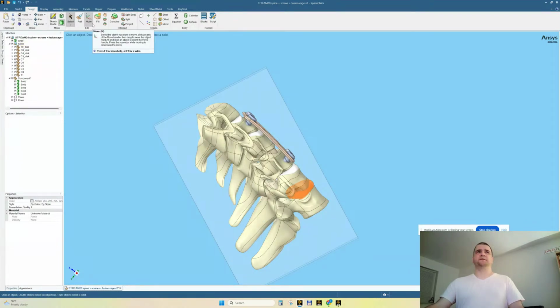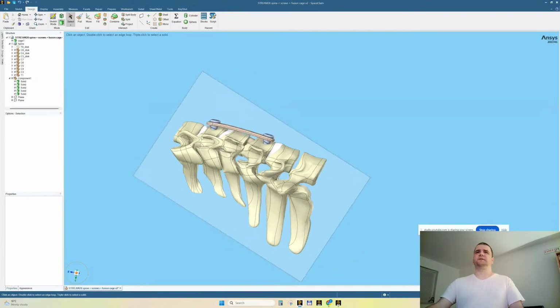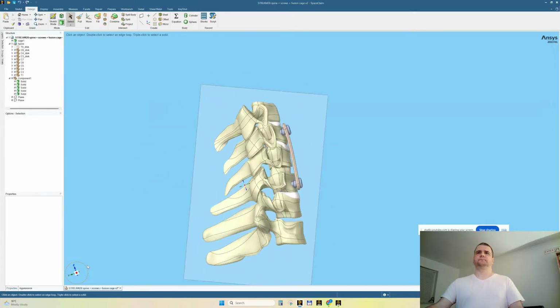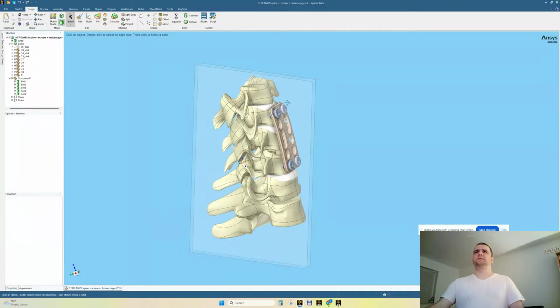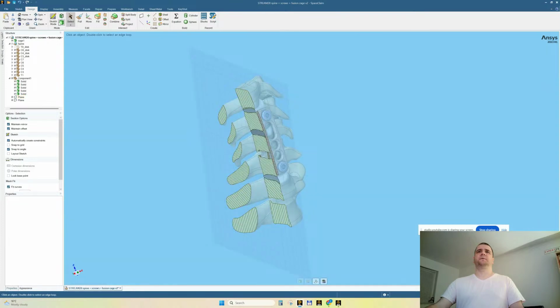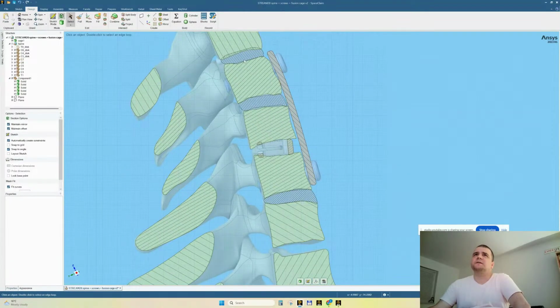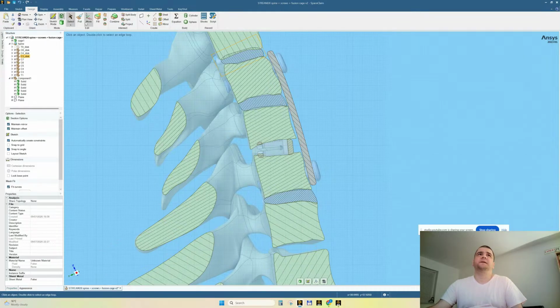Let me copy paste this. No, let me hide it, because it's too big. So I was kind of suggesting to have another disk here. So let's go here in section view. I need a very disk. I don't know which one. This one is the nicest, let's say. Yeah, let's see if I can move it. Just asking for a friend with Control pressed.